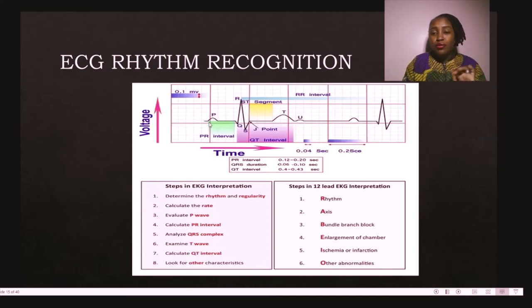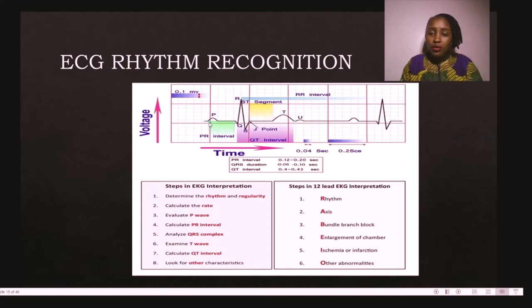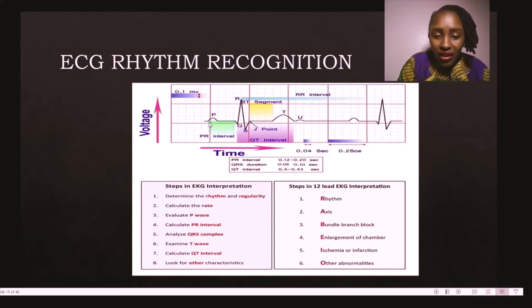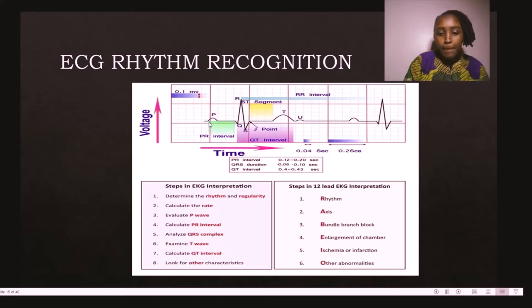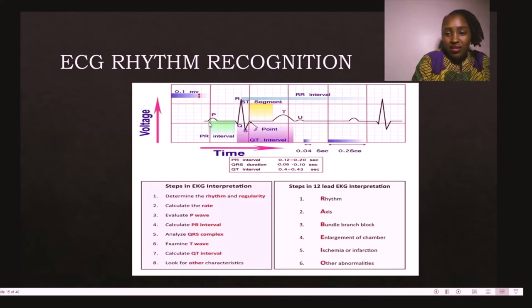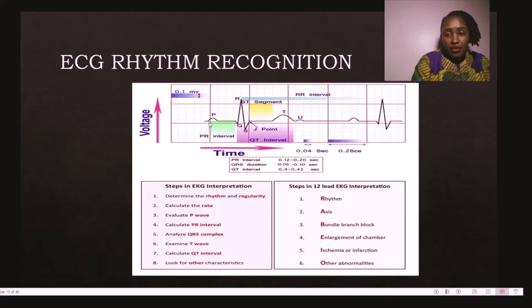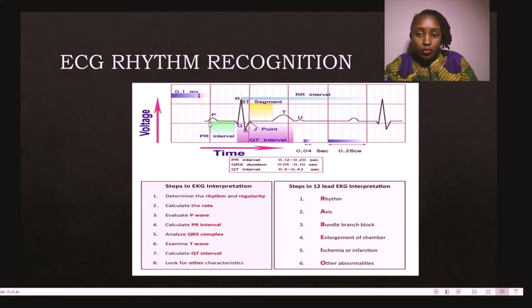The fourth criterion is the PR interval. If there is a P wave and a QRS complex, you should be able to measure the PR interval and determine whether it is normal, prolonged, or shortened — different measurements mean different things. The fifth criterion is the QRS complex — is it of normal width, too wide, or too narrow? A narrow QRS complex indicates a problem originating either from the atrium or above the ventricles, while a wide QRS complex indicates the problem is coming from the ventricular side.